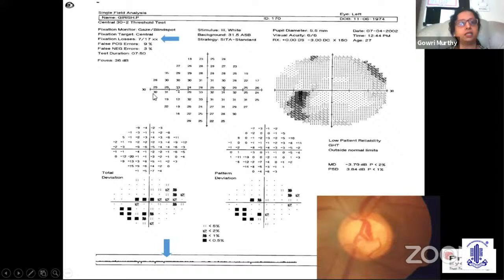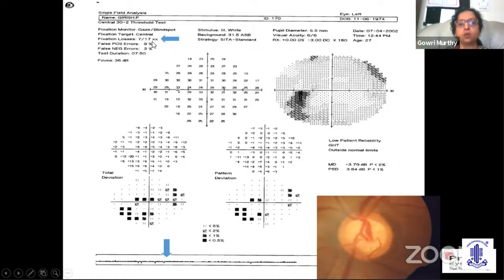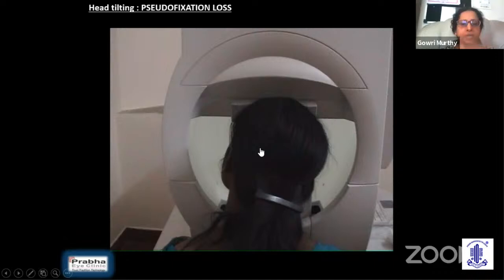Here the fixation losses are marked as 7 by 17, and the field has been marked as low patient reliability. But if you look at the gaze tracking, the infrared tracking shows that the upward deflections indicating eye movement are practically very small — the patient actually maintained fixation. Why does this happen? As the test was going on, the patient started to tilt her head, so the blind spot moved. What was initially marked as the blind spot had now moved, and therefore this is a pseudo fixation loss. The patient's head should be central and straight.